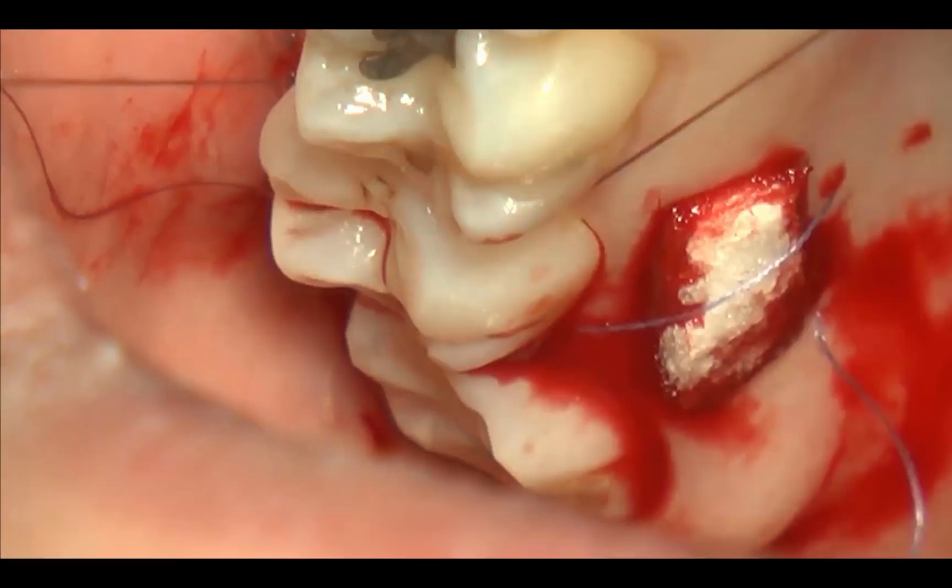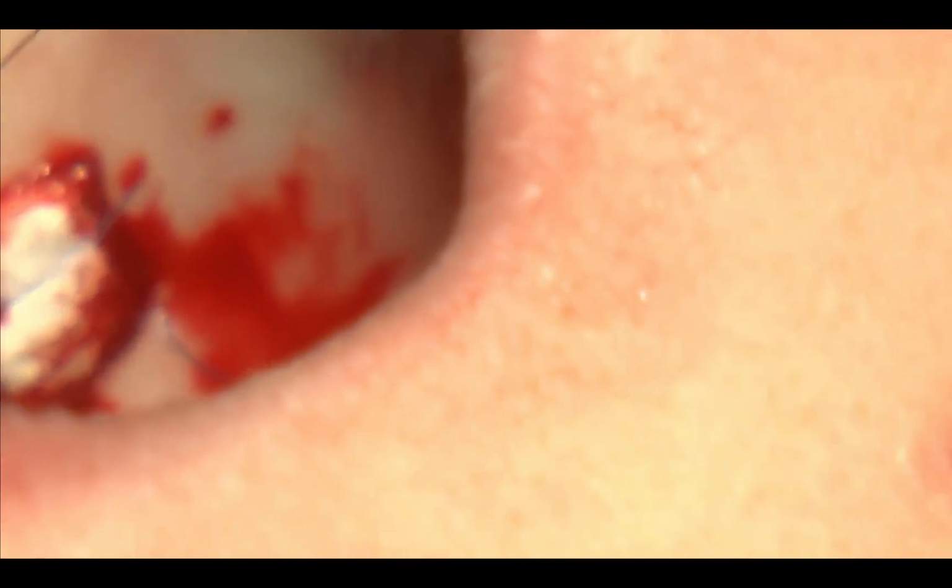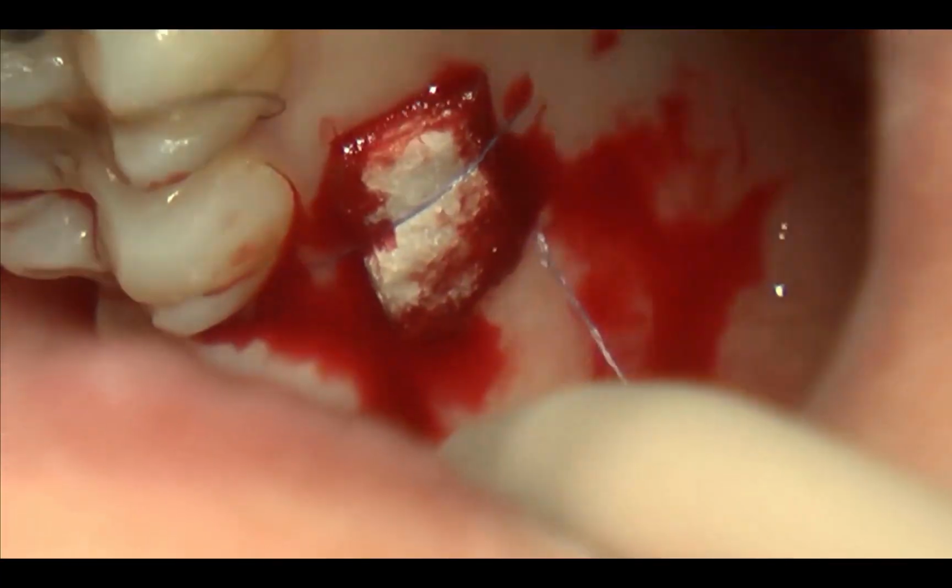And it's very important to close the knot. Distal and apical.